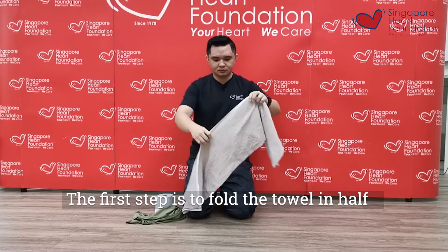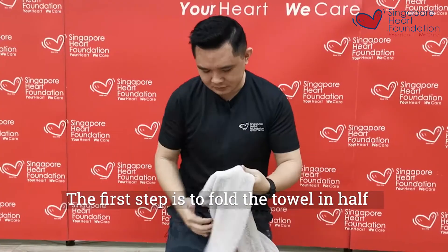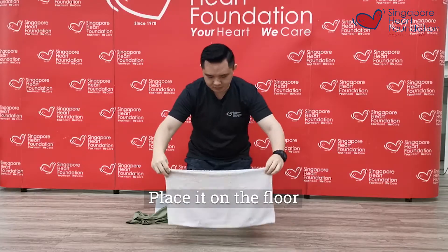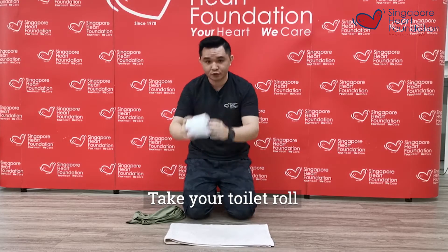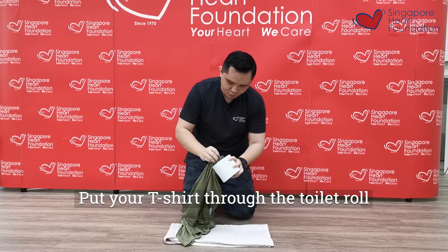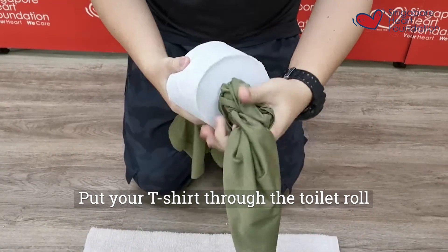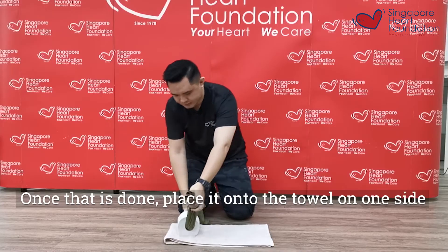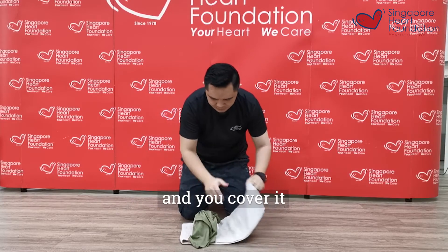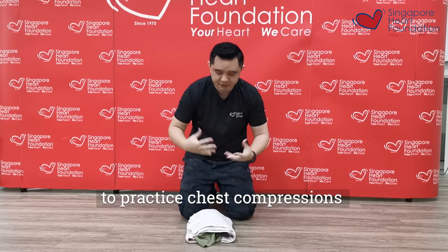The first step is to fold your towel in half. Second step, fold it into another half and place it on the floor. Then take your toilet roll, take your T-shirt, and put your T-shirt through the toilet roll like this. Once that is done, place it onto the towel on one side and cover it — it gives you a nice little bump to practice your chest compression.